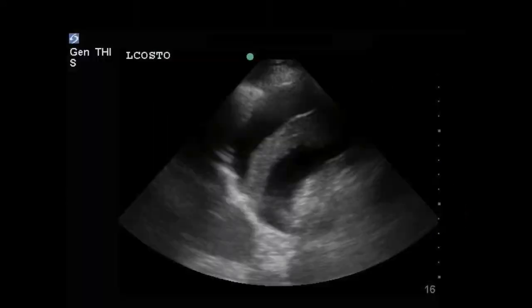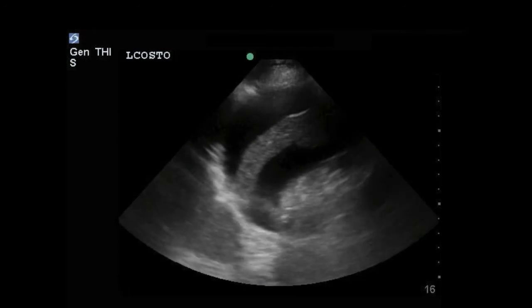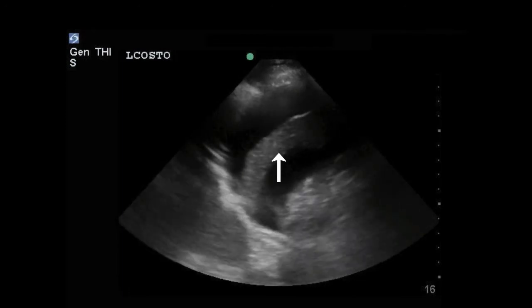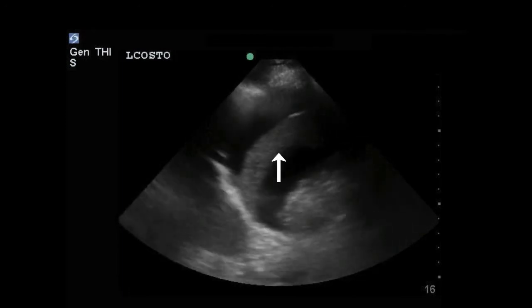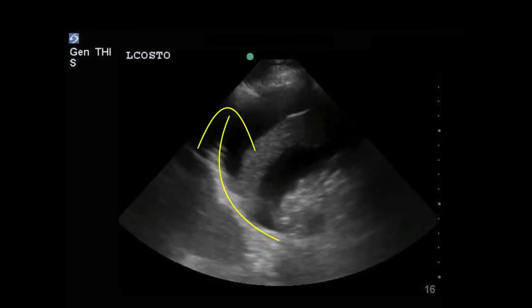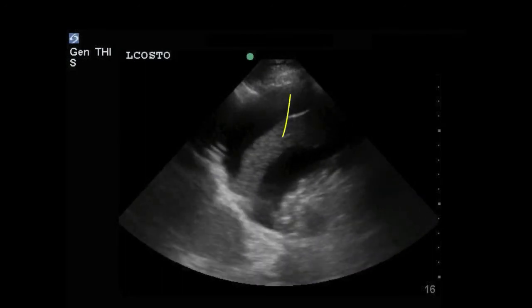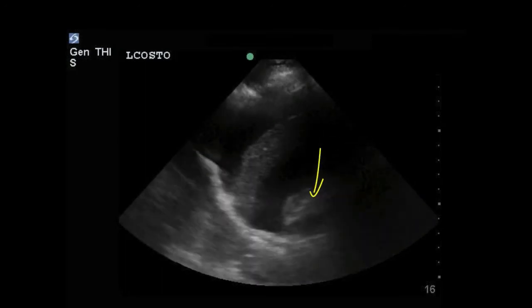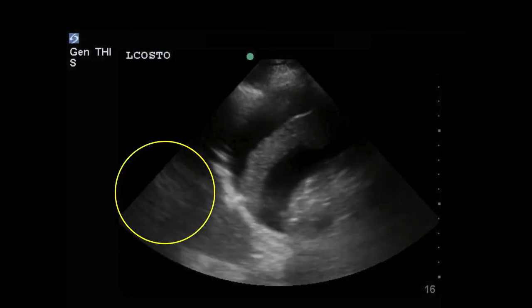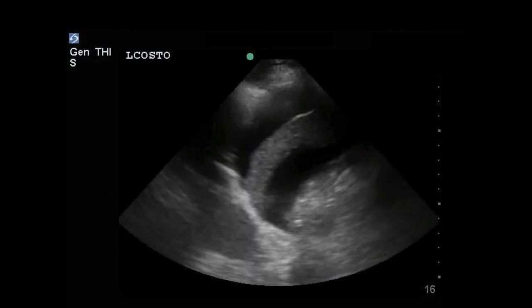Here's an example of a false positive pleural effusion. Now, a novice sonographer might look at this and declare that perhaps this is lung, as it is surrounded by anechoic space. But if you look closely, you might understand that, first of all, this is the diaphragm. And below the diaphragm is the anechoic space. Therefore, these organs here are likely the spleen and the kidney, and the pleural space is in fact above the diaphragm. Therefore, it is critically important that you understand the margins of a pleural effusion.